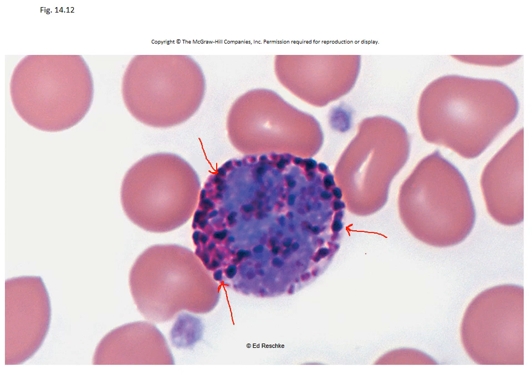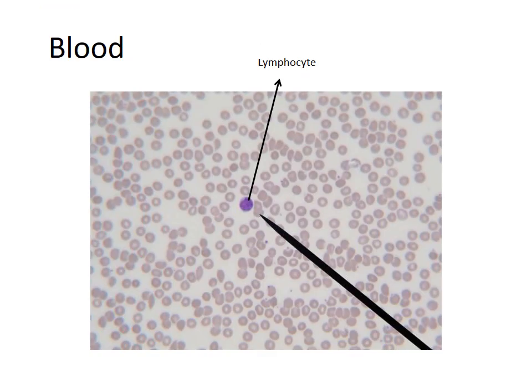So I do want you to know basophils have histamine and heparin in them. But again, it is the dark purple, dark blue cell. So those are the three types of granulocytes. Again, neutrophil: multi-lobed nucleus, weird shaped nucleus. Eosinophil: red granules. Basophils: blue granules. So now we're going to look at the agranulocytes.